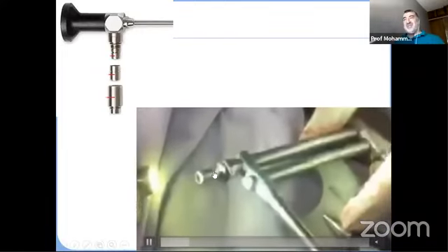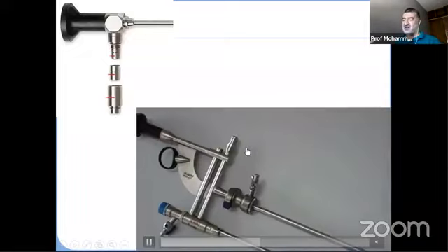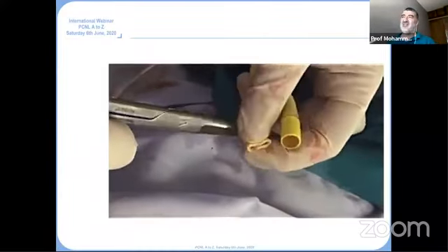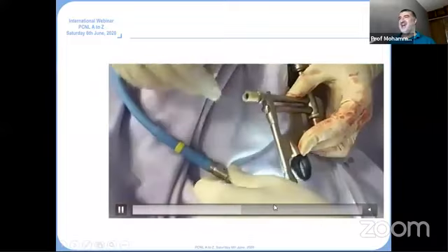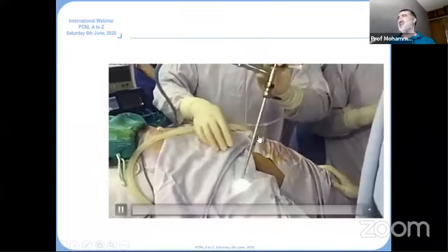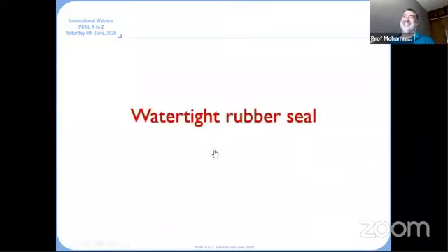So I was with a friend doing PCNL, and he had lost this light adapter, and we didn't have one, and we could not take one from another endoscope. So what do we do? What will you do? We had this idea to use a small segment of a Foley catheter, and it fitted just fine. And we did the whole procedure like this. And afterward, my friend didn't buy the adapter since he had this cheap alternative.